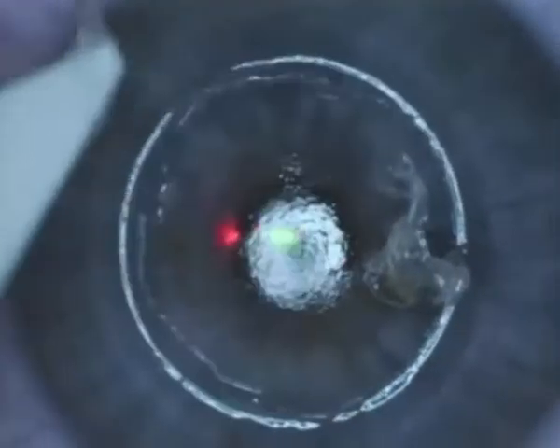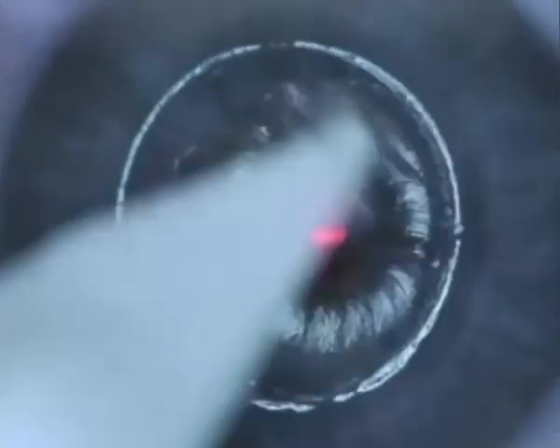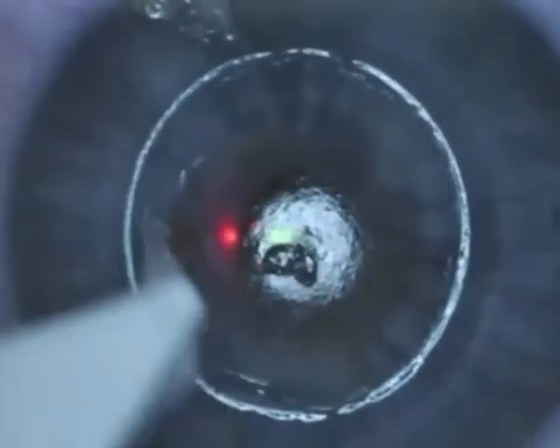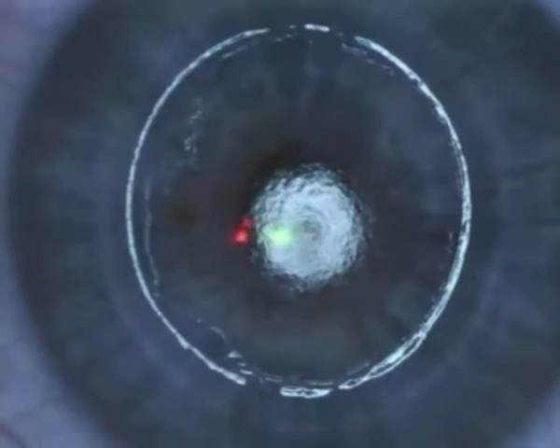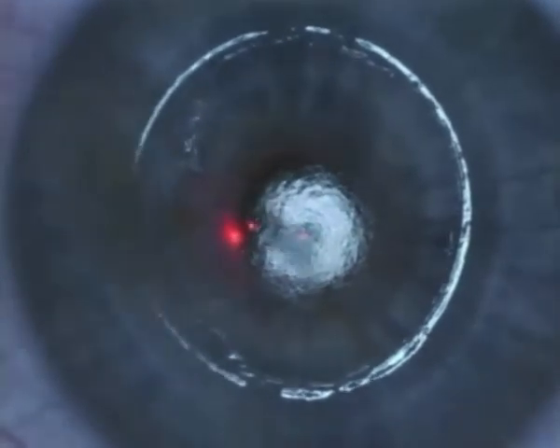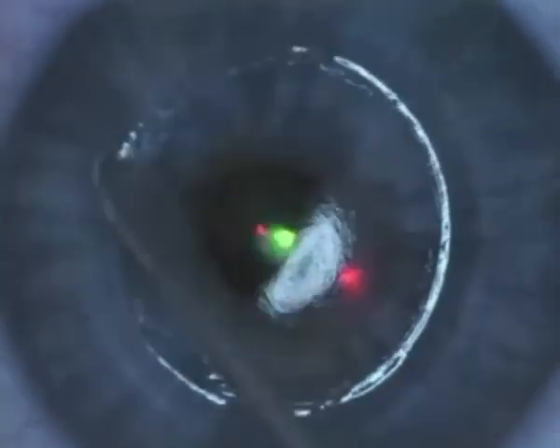And as you can see here with the dry sponge, we can very easily wipe the epithelium off. All the hemidesmosomes have been broken down by the alcohol. Most of the epithelium has been removed quite simply by just wiping away. The remaining epithelium we will scrape off using a very blunt hockey stick.